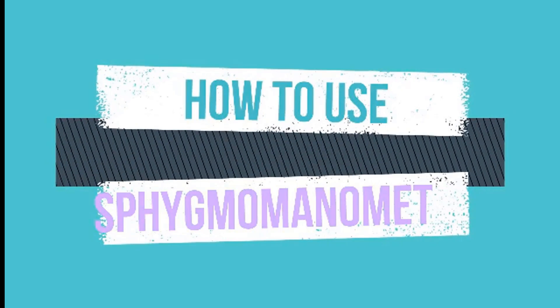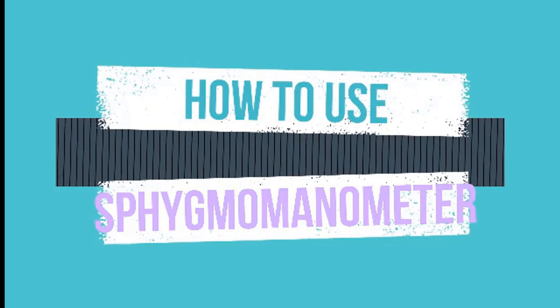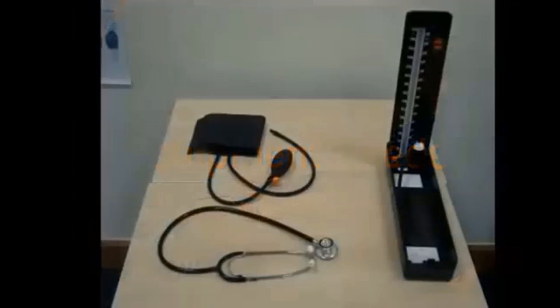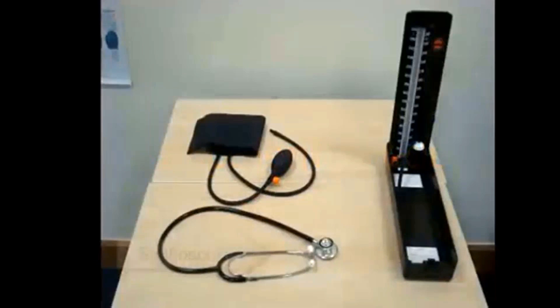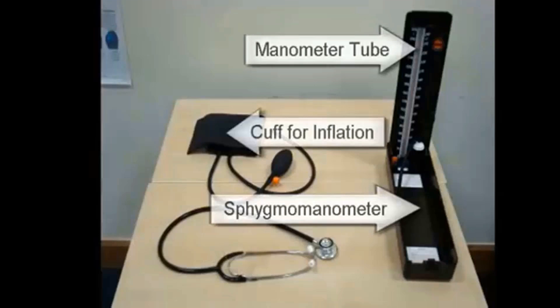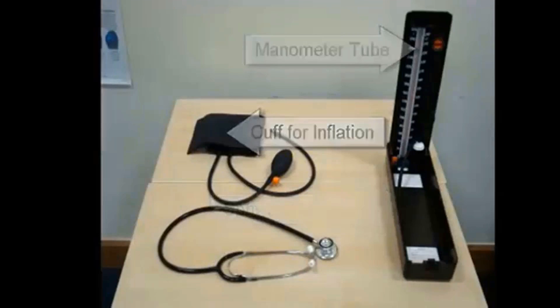How to use a sphygmomanometer. What you will need is a quality stethoscope, an appropriately sized blood pressure cuff, and a blood pressure measurement instrument — the sphygmomanometer.